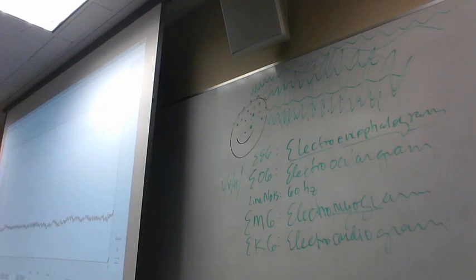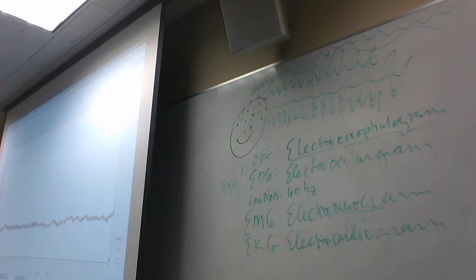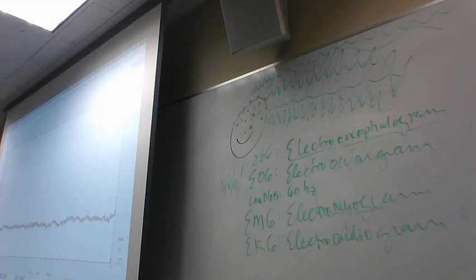So when we slice it 300 times, we'll have epoch 1, epoch 2, epoch 3, epoch 4, epoch 5, etc. You guys follow? Now, this is all, let's say, for electrode AF4, anterior frontal electrode number 4, right here. Okay, so this is just one electrode.